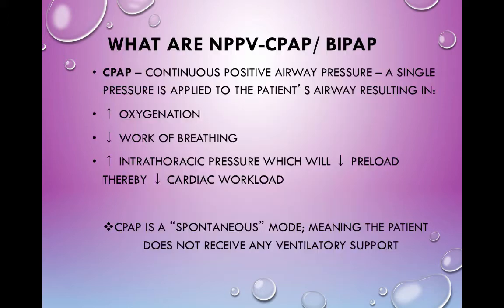So CPAP and BiPAP. We're going to start with CPAP. So CPAP, continuous positive airway pressure. This is a spontaneous breathing patient, so it's not PEEP. But it could be, same knob, same thing. But we're going to call it CPAP because it's a spontaneously breathing patient.